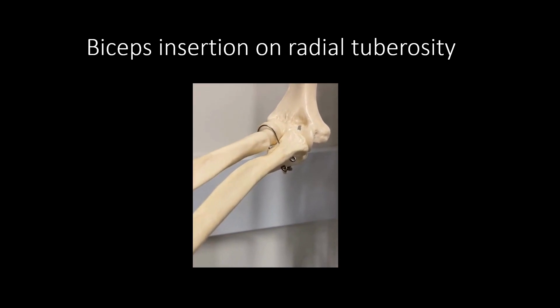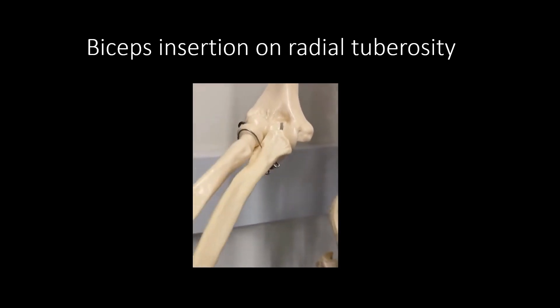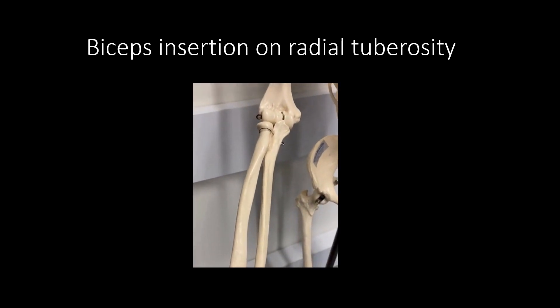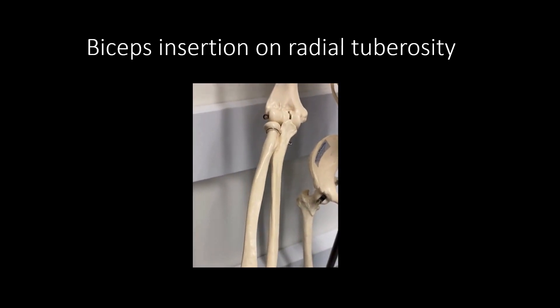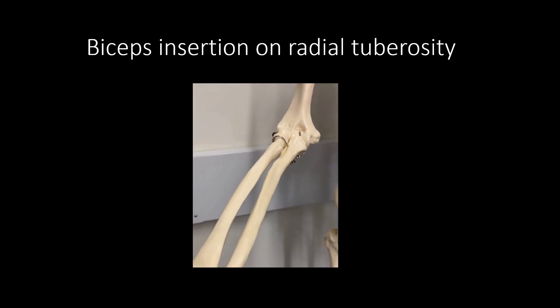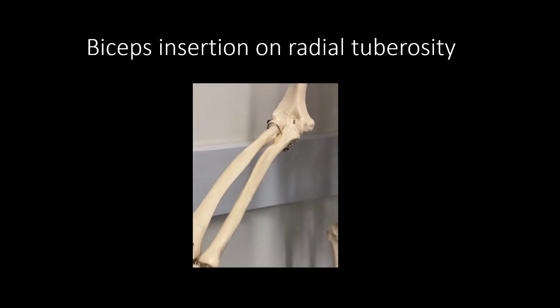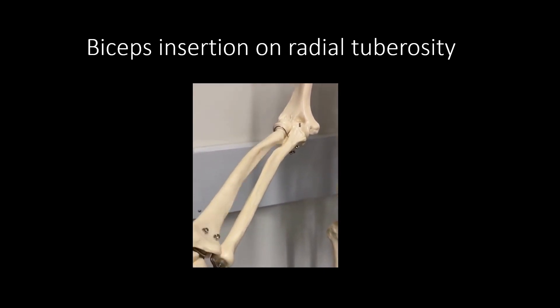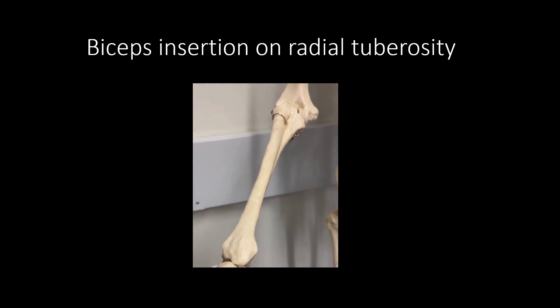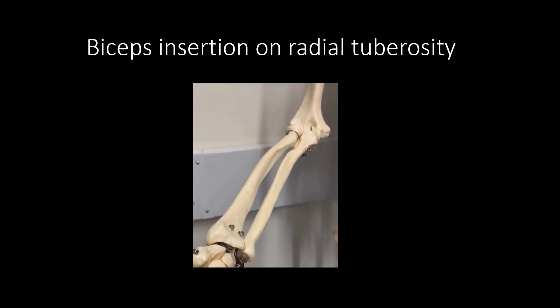For the scanning position discussed in this video, we have the arm in the supinated position, so the radial tuberosity is very easily identifiable, and therefore we can see the insertion of the biceps quite well on ultrasound.